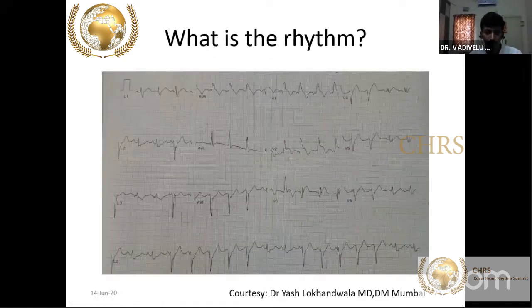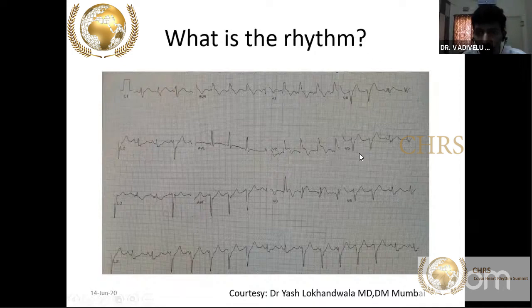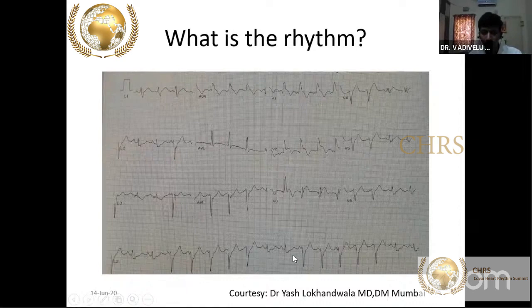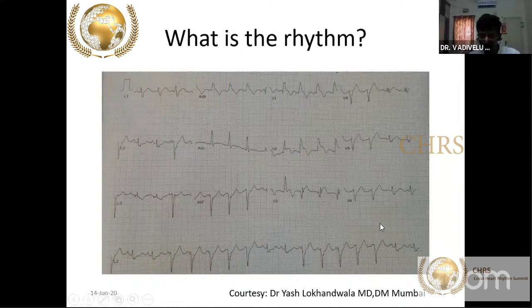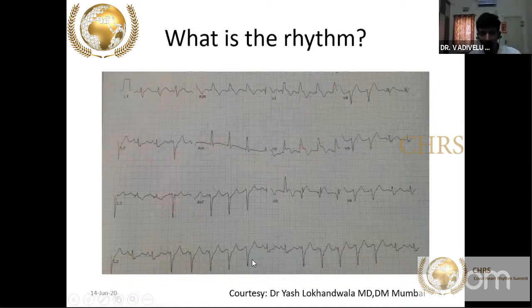In acute anterior wall MI with Q waves in V1 to V4, an idioventricular rhythm can emerge — wide QRS with loss of PQRS relationship. Idioventricular rhythm does not always represent successful recanalization. In idioventricular rhythm there is isorhythmic AV dissociation, and the P wave often hides inside the QRS. This patient alternated between sinus rhythm and idioventricular rhythm complexes.